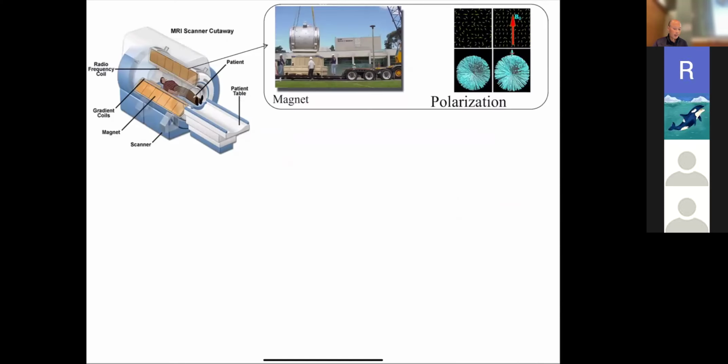Okay, so now we're going to start slowly diving into some of the more details of what's going on. So there's four main topics you sort of have to get familiar with that an MRI system does. Okay. The first is called polarization.